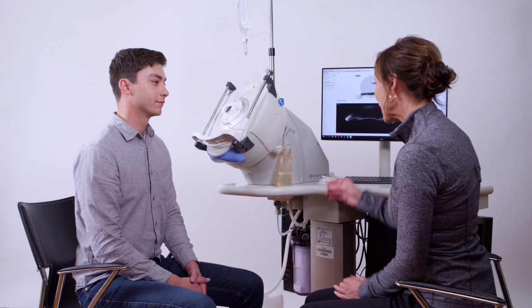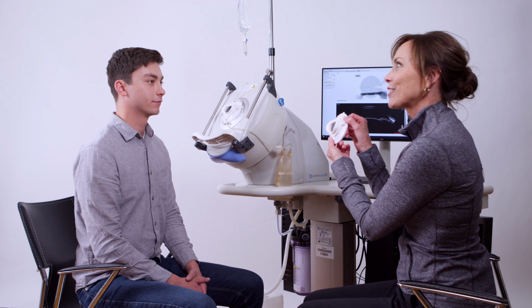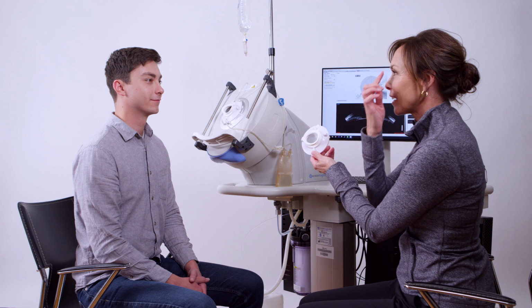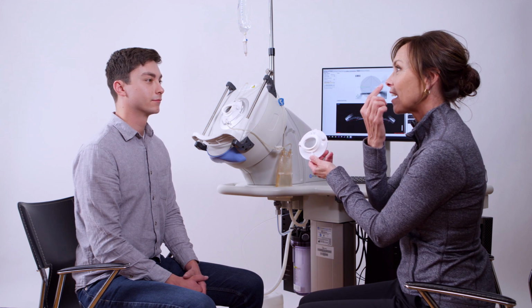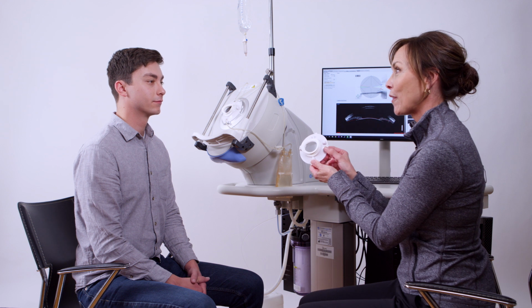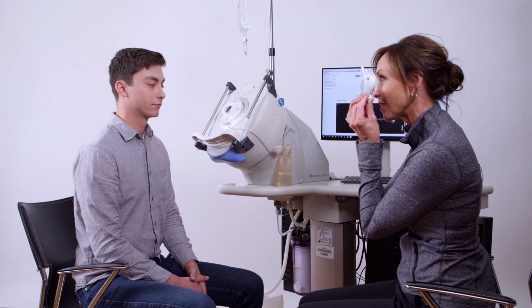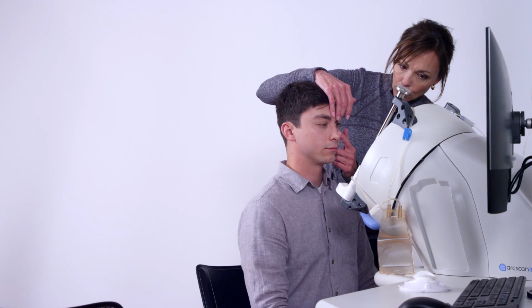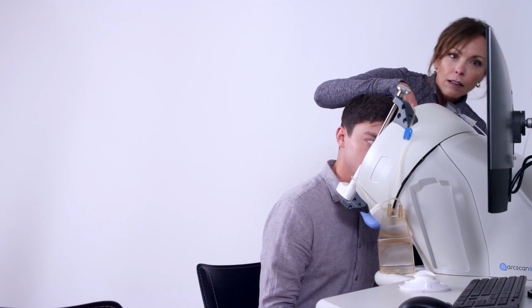You'll be positioned against this EyeSeal. You can see that the EyeSeal looks like a swim goggle, intentionally, as it fits much like a swim goggle. The top here will be against the brow bone, and then against the nose, and finally against the temple and the cheek. You just want to have contact all the way around. In this case, of course, instead of keeping the water out, we're keeping the water inside the goggle. We'll also want the lids to be open as much as possible to get the best scans.